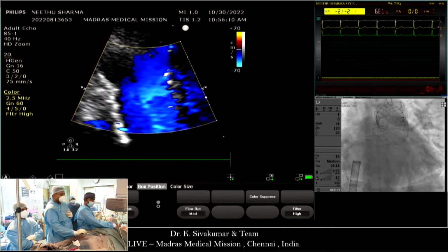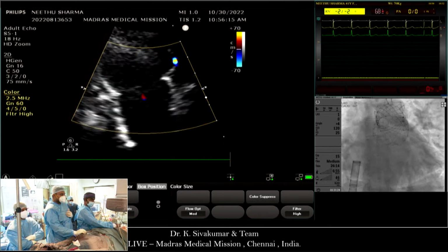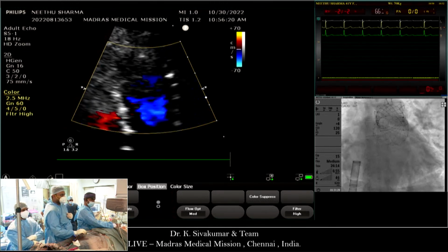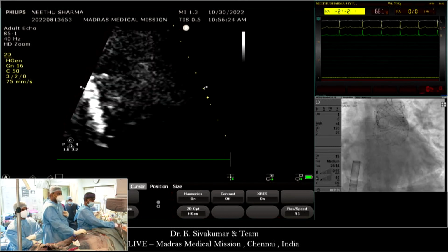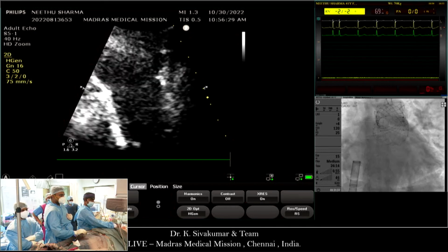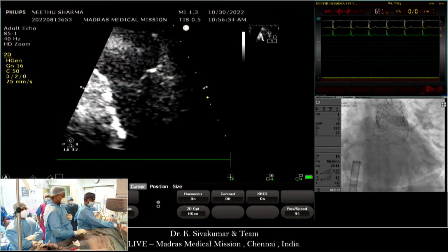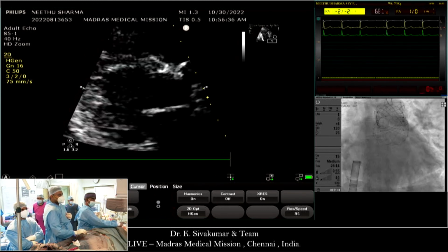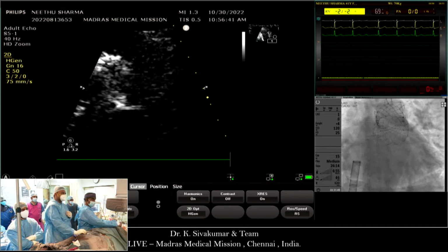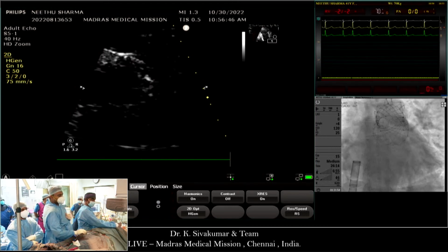Jack, have you seen HALT phenomena after these? HALT, by the way, is hypoattenuated leaflet thickening, and that can sometimes simulate a thrombus. Not acutely, but we had one patient about 2 or 3 months later with leaflet thickening. We treated it as if there was microthrombus formation with heparin, and that got rid of the gradient. So it can happen.